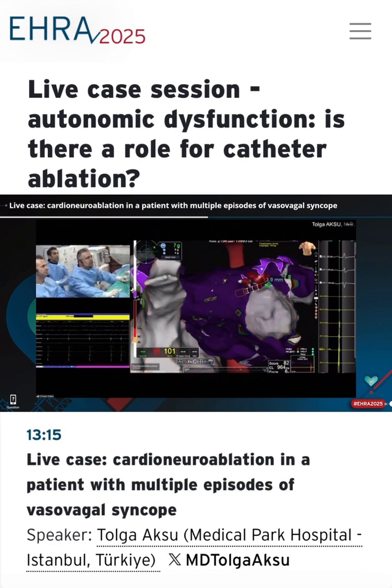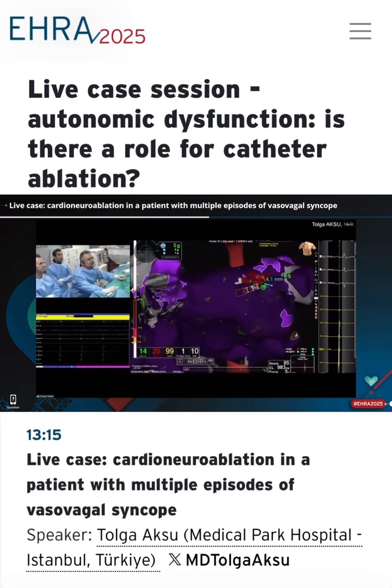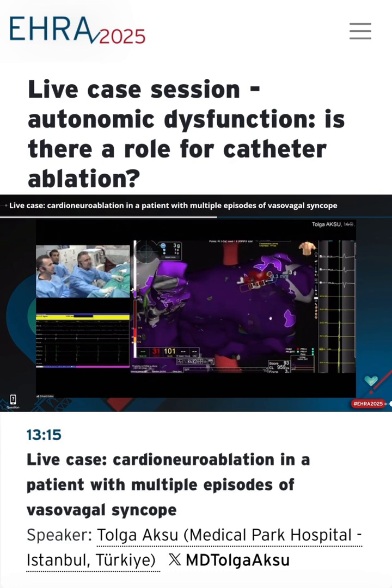If you ask any question about extracardiac vagal stimulation, we don't use it, because extracardiac vagal stimulation only shows the parasympathetic innervation effect on the sinoatrial node and AV node area. So just performing ablation in this area, you can eliminate extracardiac vagal stimulation and you cannot see anything about the GP site. So look at that.